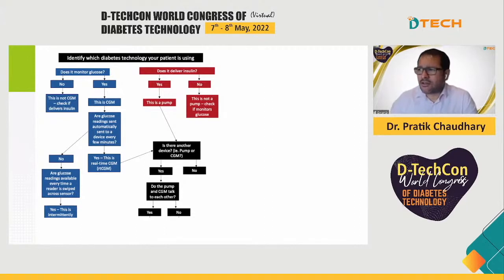And what we're realizing is that a lot of people using technology are going into hospital, being seen by emergency care physicians, seen by surgeons who don't know what the technology is. They think they know what it is. And that's led to a lot of mistakes and errors in hospital. So it's a simple guidance.